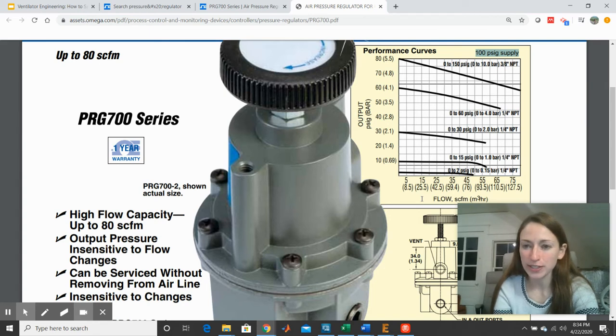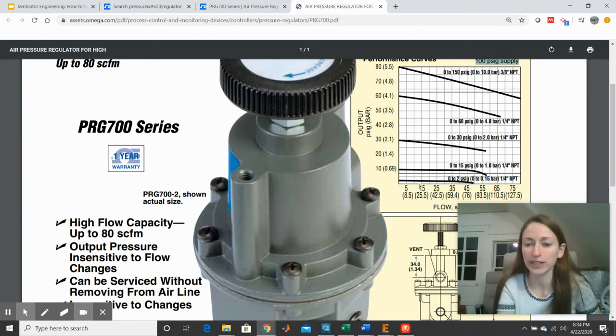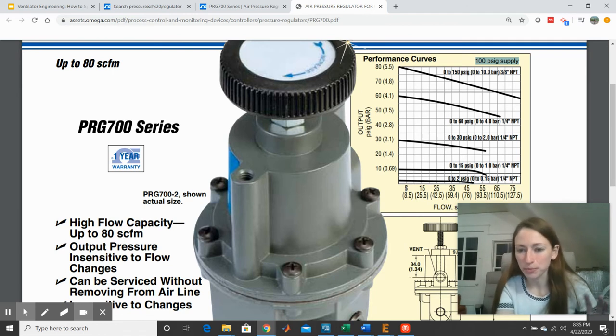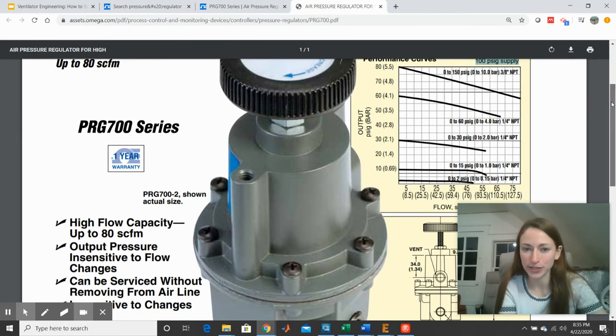And what I'm looking for here is nothing super quantitative or precise, because this is a performance curve for a higher inlet pressure than we have, but I'm really looking for the linearity of this curve. I can assume that the characteristic of the curve will be conferred over to a 50 psi supply pretty reasonably. And because this is pretty linear, I'm confident that this regulator will probably still work for our application. So it's really important to look for these performance curve plots and see if you can understand to what extent this device will work for your application. Okay, hope that wasn't too confusing, but it's really important to check for these.